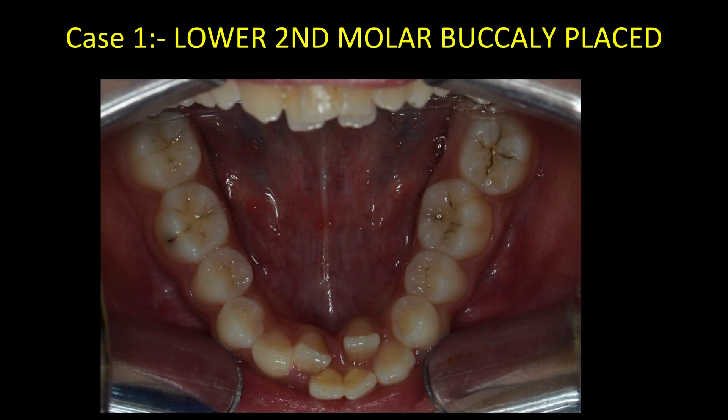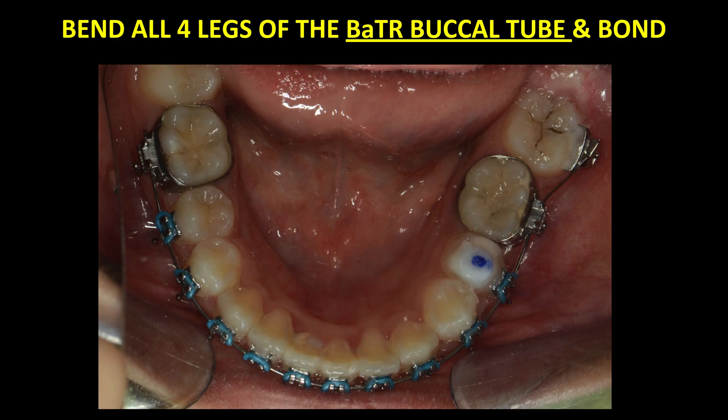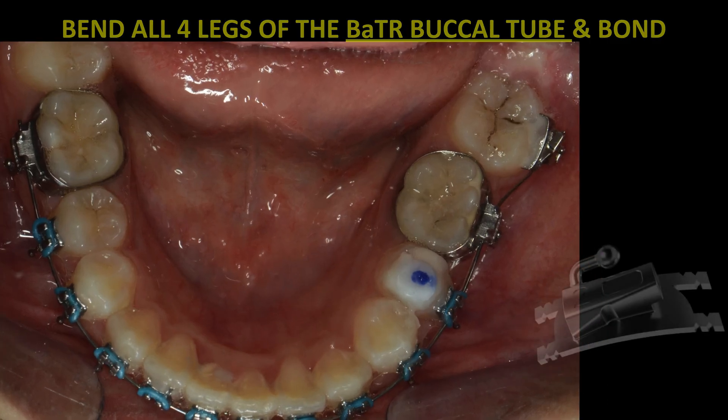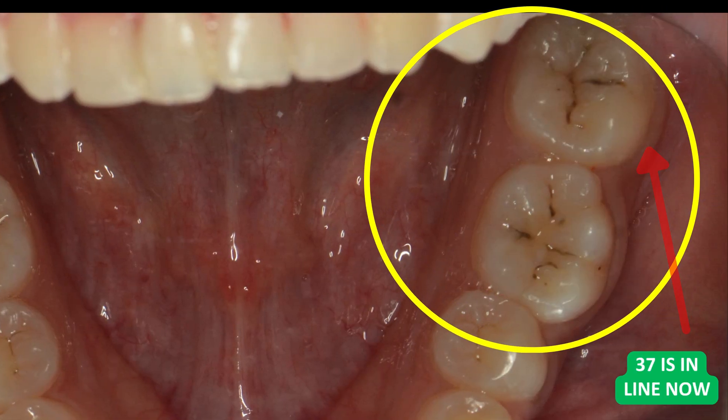Case 1: a lower second molar placed buccally. By bending all four legs of the BATR buccal tube and bonding, tooth 37 came perfectly into line.